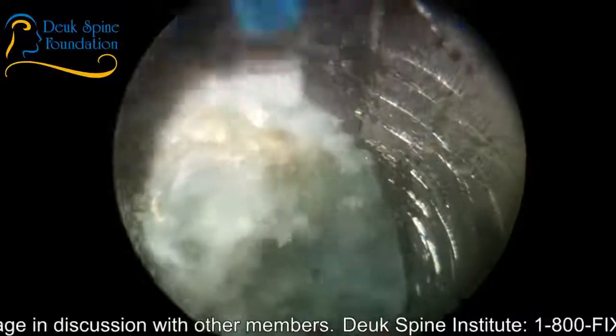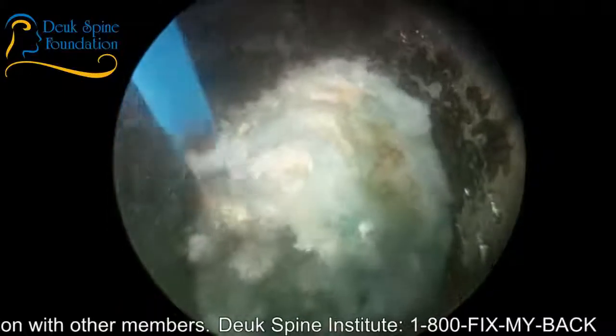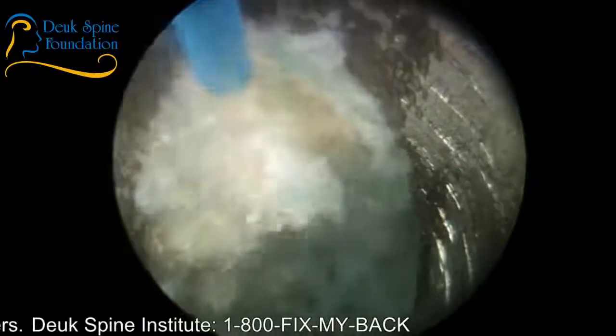I got to free it up from the scar tissue. This is the scar tissue. And then what I'm trying to do is break it up a little bit at a time. As a matter of fact, I'd like for it all to come out at one time.